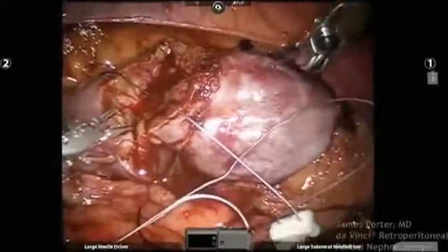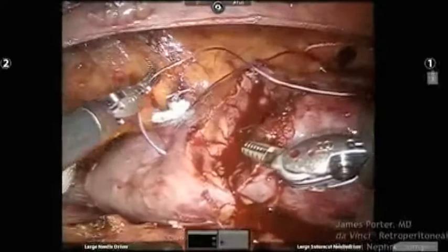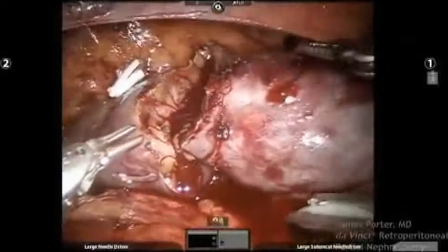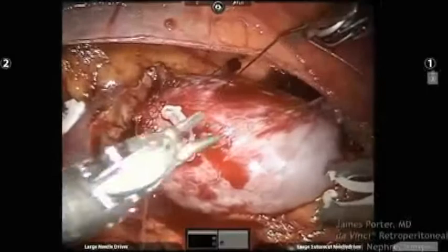I think the main reason that's probably occurring is if you just have a bad hemostatic closure and you are not getting the vessels very well, whether it's individual ligation of vessels or a deep running layer. You just have to get it in some fashion. And perhaps that parenchymal closure that he's doing right now, the parenchymal apposition, is as important as anything else. So you can see that in that initial stitch alone, about 50% of that defect was closed. Now with the capsular sutures being placed, that'll continue to close that defect.